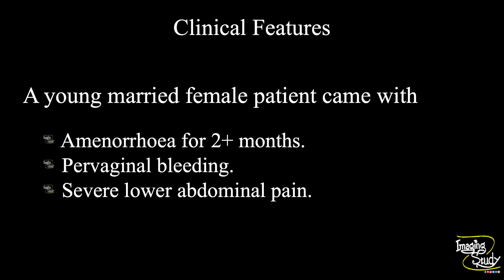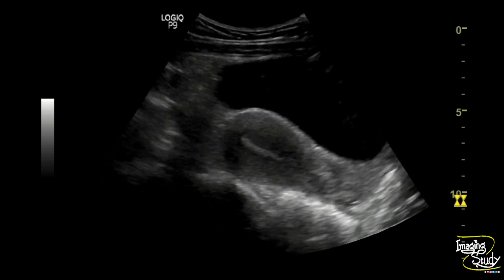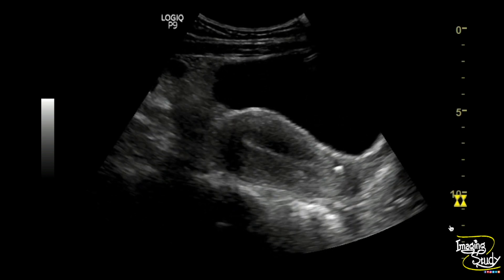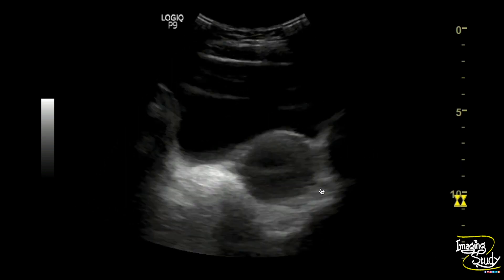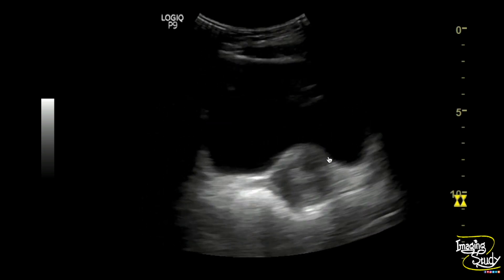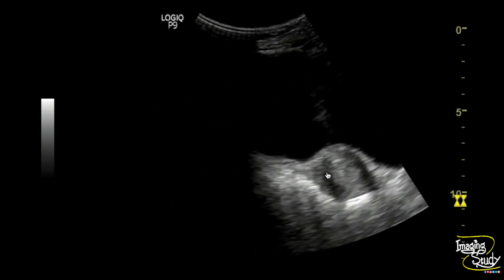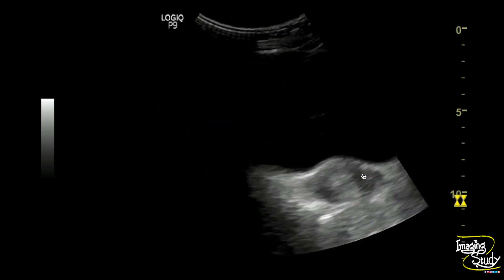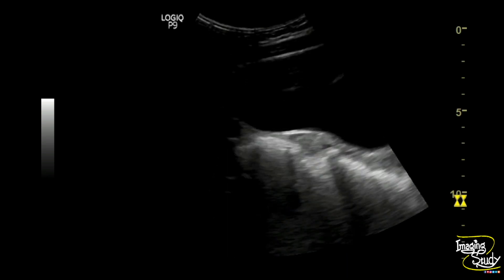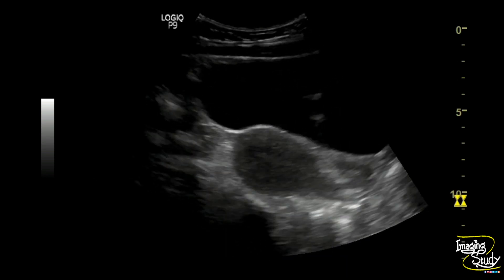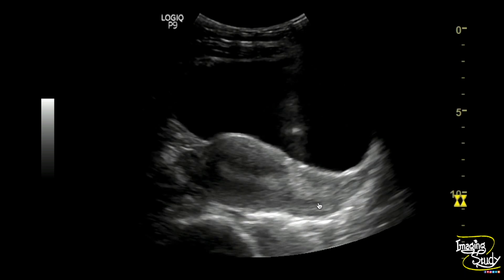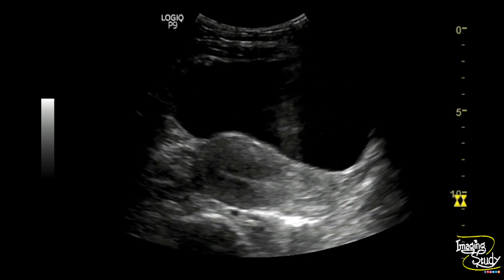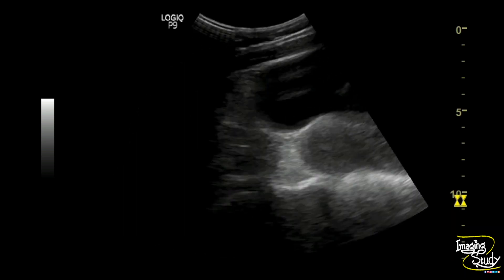Let's see what we have got on ultrasound. Here you can see the longitudinal section of the uterus. You can see some heterogeneous mixed echogenic area at the lower uterine cavity, which is quite well visualized on the transverse section. Again on the longitudinal section, you can see this mixed echogenic hyperechoic area at the lower uterine cavity, predominantly in the cervical cavity.